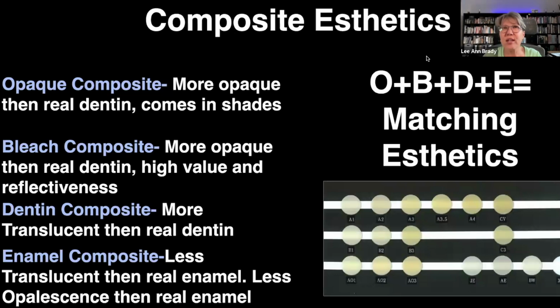Like you would do the whole thing just with the characterization shades or just with the enamel shades in the Genial system, right? But then you also have composites that are going to create the chroma and have the relative opacity of actual real dentin. So you need to understand what these 4 categories are like in your system. And then all you need to do is figure out what's my recipe. Can I do it with one layer? Is there one layer of my composite kit that matches the value, the chroma, the hue, and the enamel characteristics of this tooth perfectly?